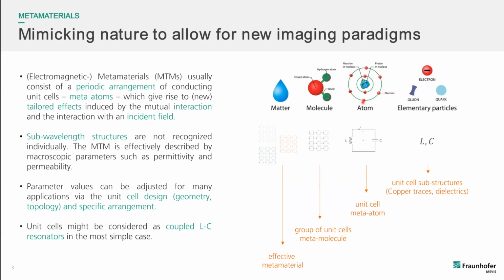And metamaterials are pretty much the same, but offer us much more degrees of freedom to actually modify the behavior of a material in terms of how it reacts to an electromagnetic wave or electromagnetic radiation.